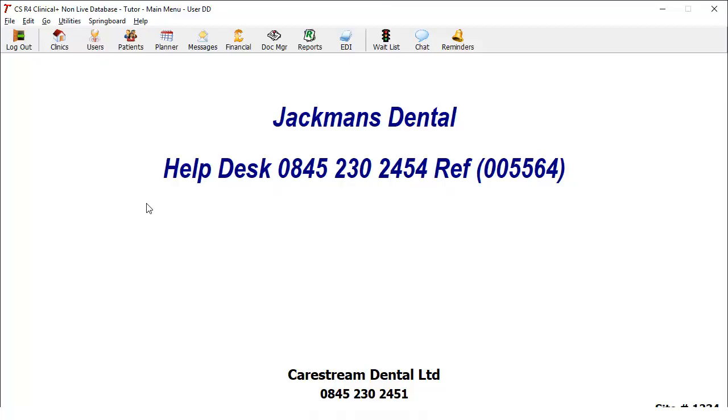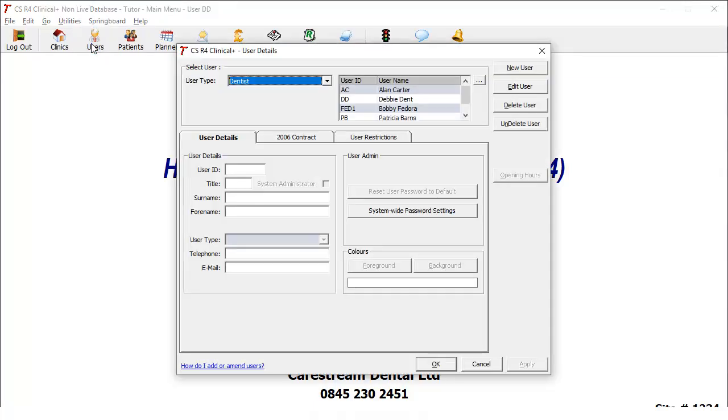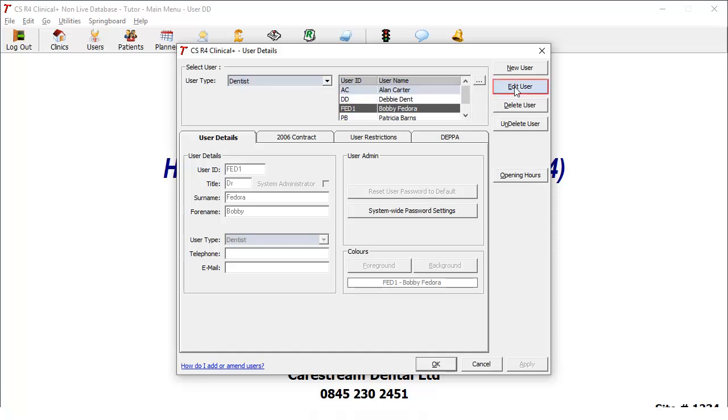In the CS R4 Plus main menu, click Users. Within Select User, click the name of the user for whom you wish to change the password. Click Edit User.